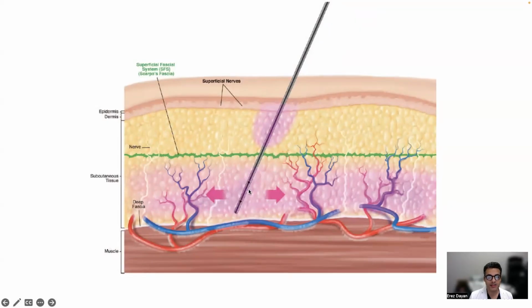So you want to numb the subcutaneous tissue deep to superficial. The nerves, you can think of them like a tree, and all the branches are by the skin. The skin is far more sensitive than the subcutaneous tissue. So if you're able to numb those trees at the root, right above the deep fascia layer, you're able to move the local anesthetic from deep to superficial. What's going to happen is after you've numbed with the 1% lidocaine with epi and then the tumescent, you're going to come in with a tumescent cannula.